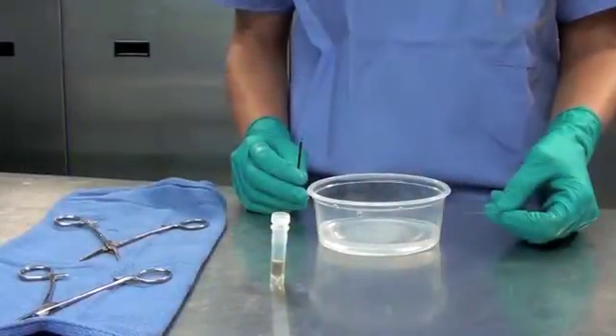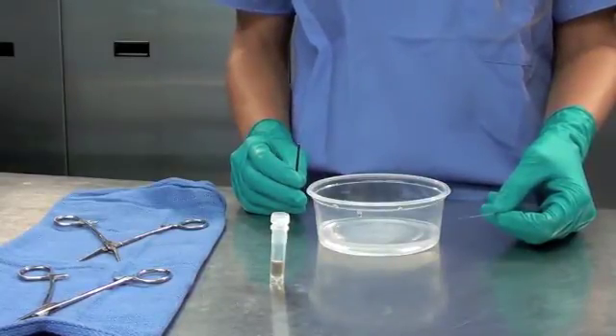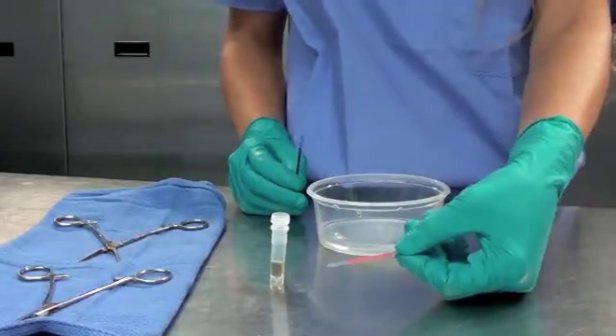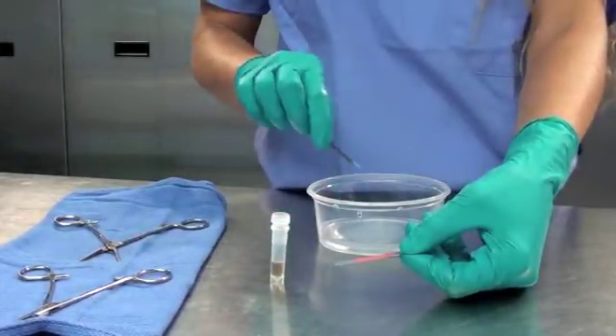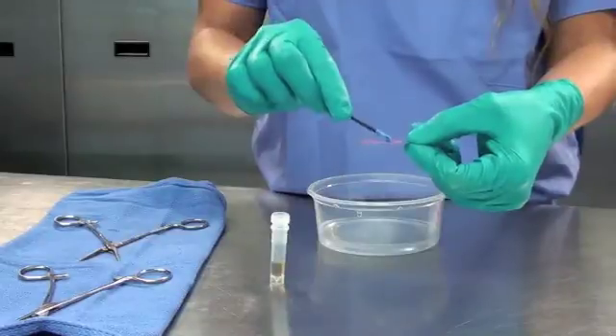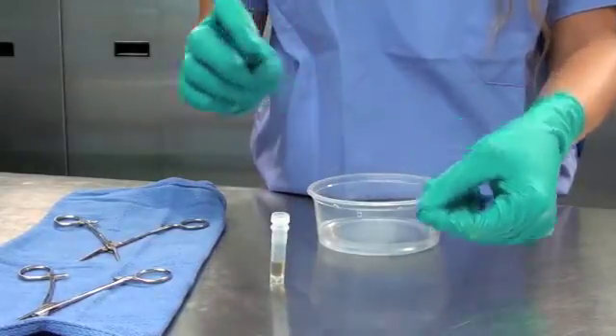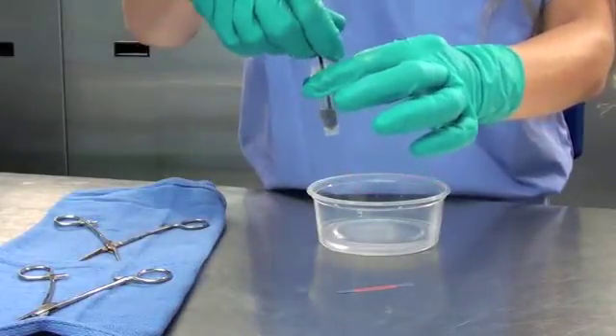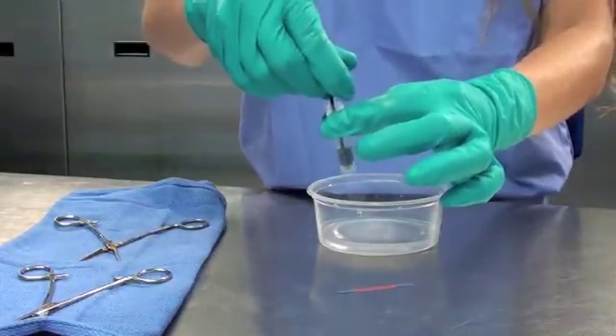The WashChex Pro is quick and easy to use with results in just seconds. First, we will run a test using one of the provided control strips included in a kit of WashChex Pro. After dipping the swab in tap water, swab the strip and swirl it in the solution within the vial for a few seconds. The strip contains a protein formula that will cause a color change to bright blue within seconds.